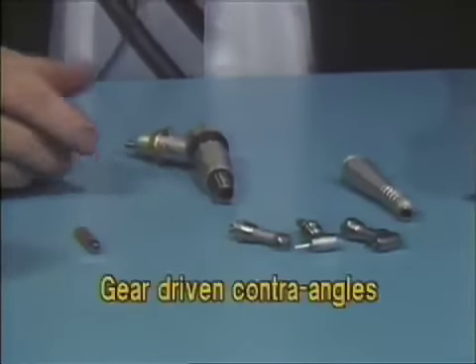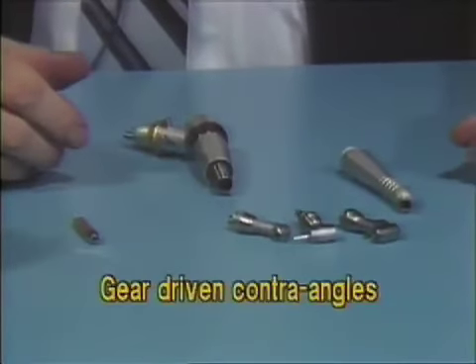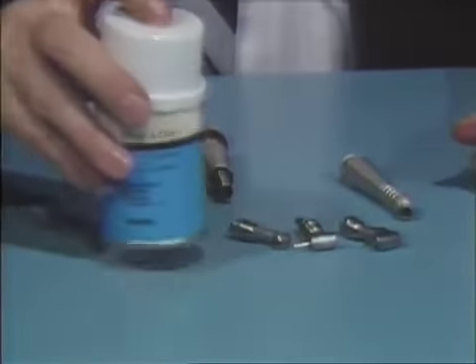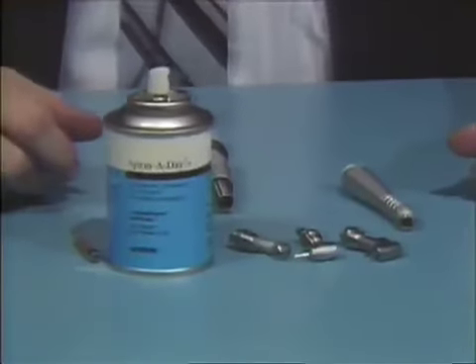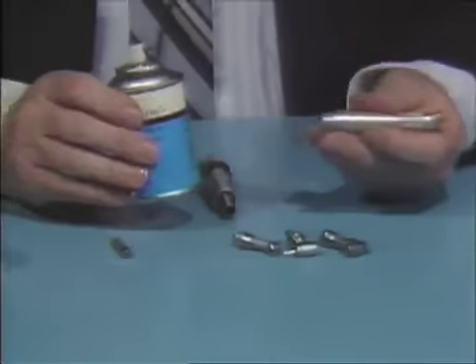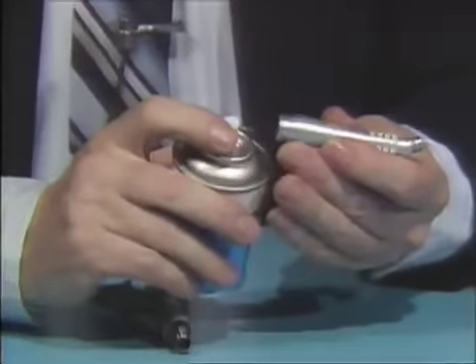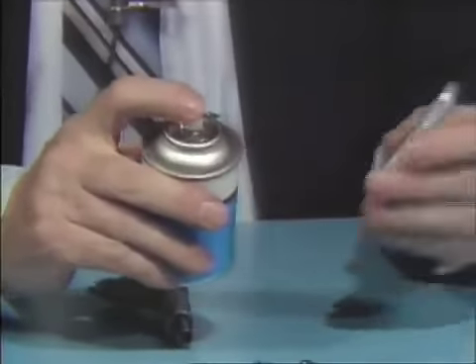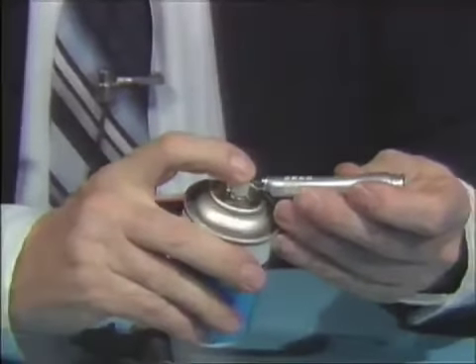This segment covers the lubrication and maintenance of the Midwest gear-driven contra-angles. The lubricant used is Spray-A-Day. Once a day, take the contra-angle sheath and spray with Spray-A-Day inside the back portion for approximately one to two seconds, then spray the front portion about one to two seconds as well.